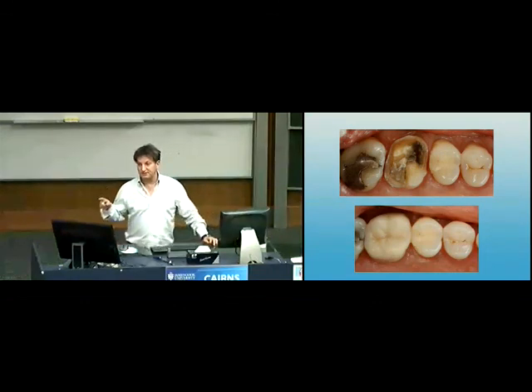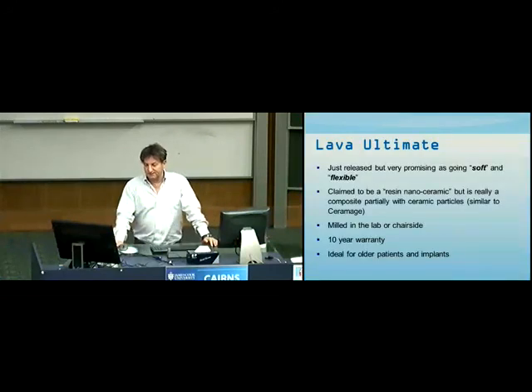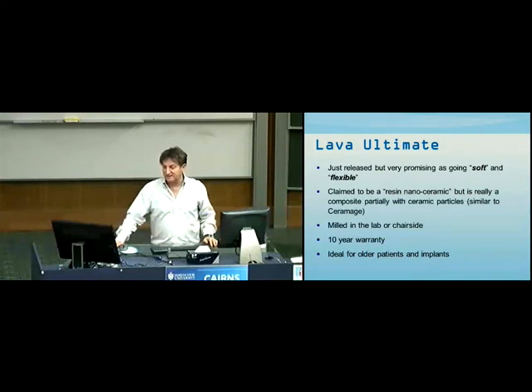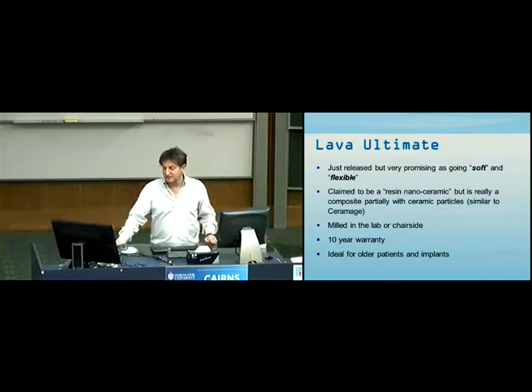If you're going to put all ceramic on here, there's potentially a drama because of those cracks that can occur. Now, Lava Ultimate's just been released. As I said, it's very promising as, again, it's soft and flexible. Now, they claim it to be a resin nano ceramic. What's that? It's basically a resin. It's a reinforced resin.